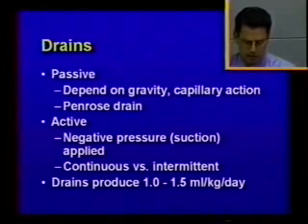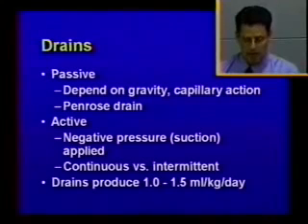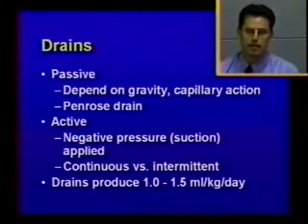To mention a few drains, we have passive drains. These depend on gravity and capillary action. An example of this would be the Penrose latex drain. And then we have active drains. These are negative suction drains, such as the Jackson-Pratt or Snyder drains. And these will apply a continuous or an intermittent negative suction to wick fluid out of the wound. And any drain will produce between 1 and 1.5 mL per kilo per day.